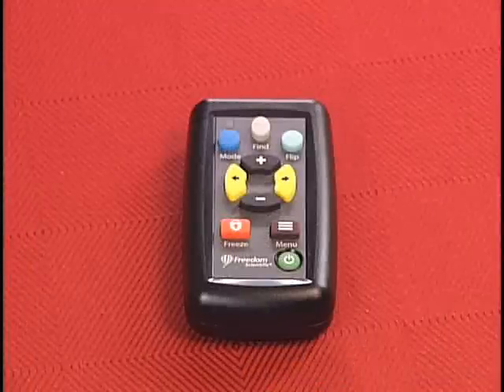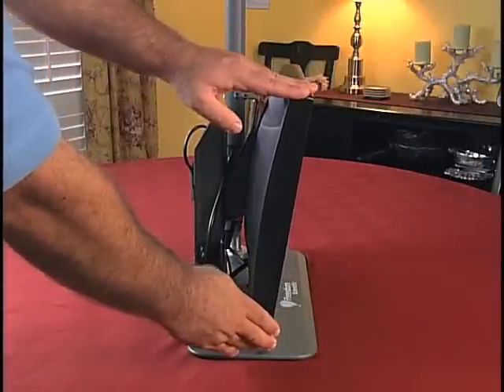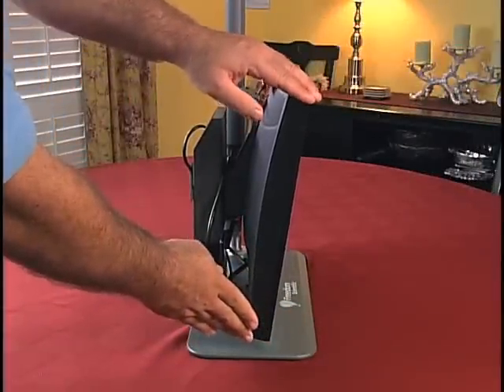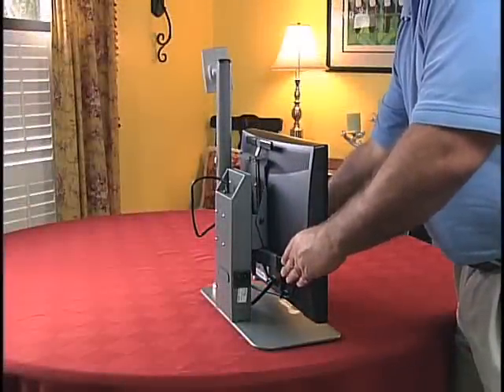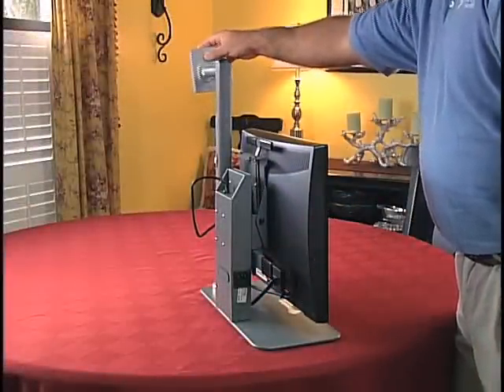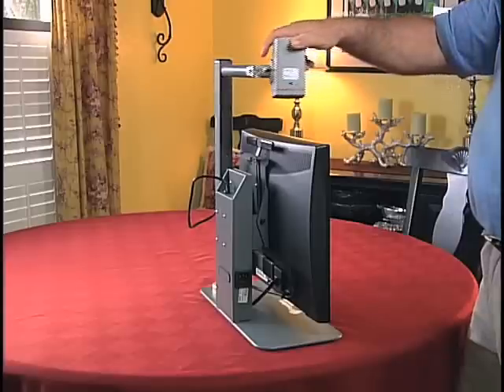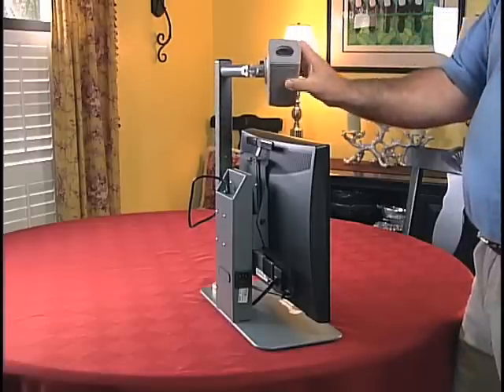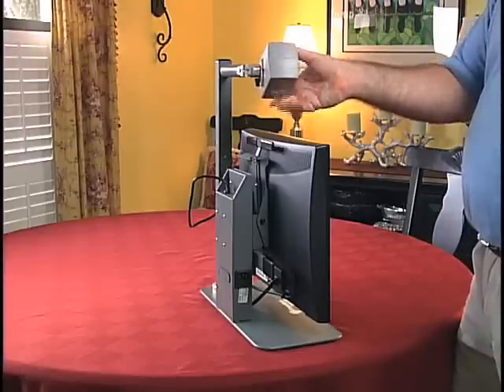I can control everything with a simple wireless remote so I don't jiggle the camera. The screen tilts forward and back and can be raised or lowered for comfort everywhere I use my Onyx. The camera arm swings 350 degrees and the camera rotates 350 degrees so I can easily look everywhere around me.